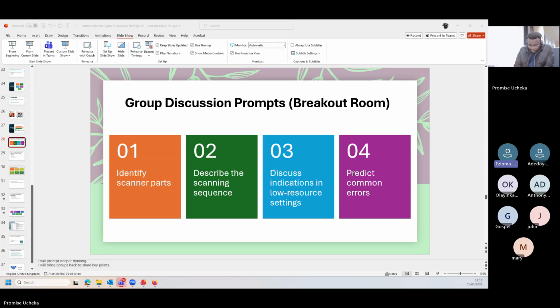Even when such cannot be managed, that gives you room to take a physical bite registration to augment the one you have on the camera. So it goes a long way to save time for you and for the patient at the same time.